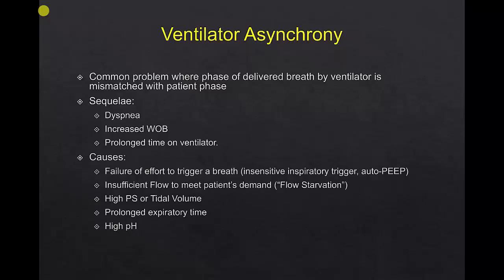Asynchrony can be caused by a failure of the patient's effort to trigger a breath, insufficient flow to meet the patient's demand, also known as flow starvation, high pressure support or tidal volume settings, prolonged expiratory time, and a high pH.